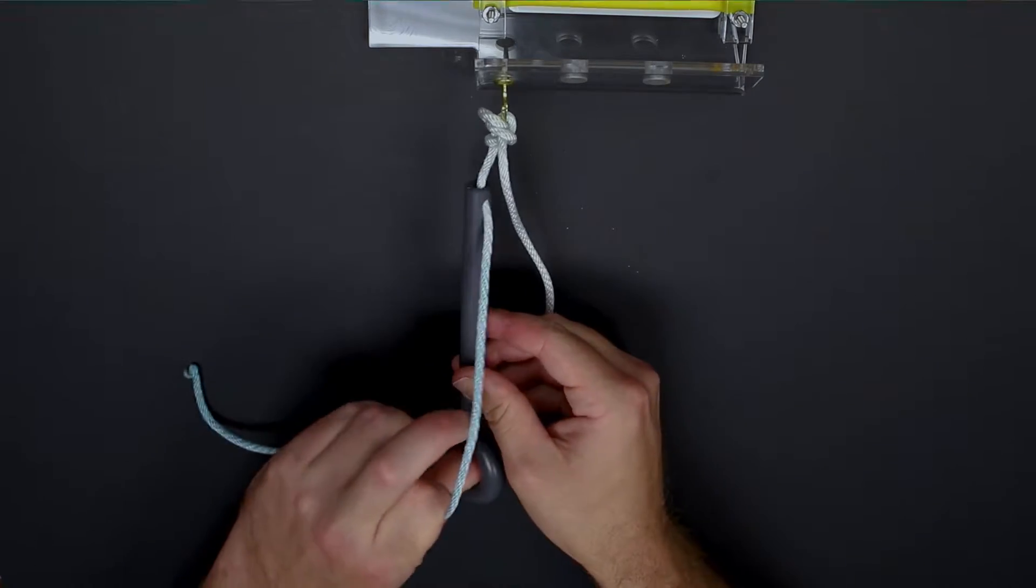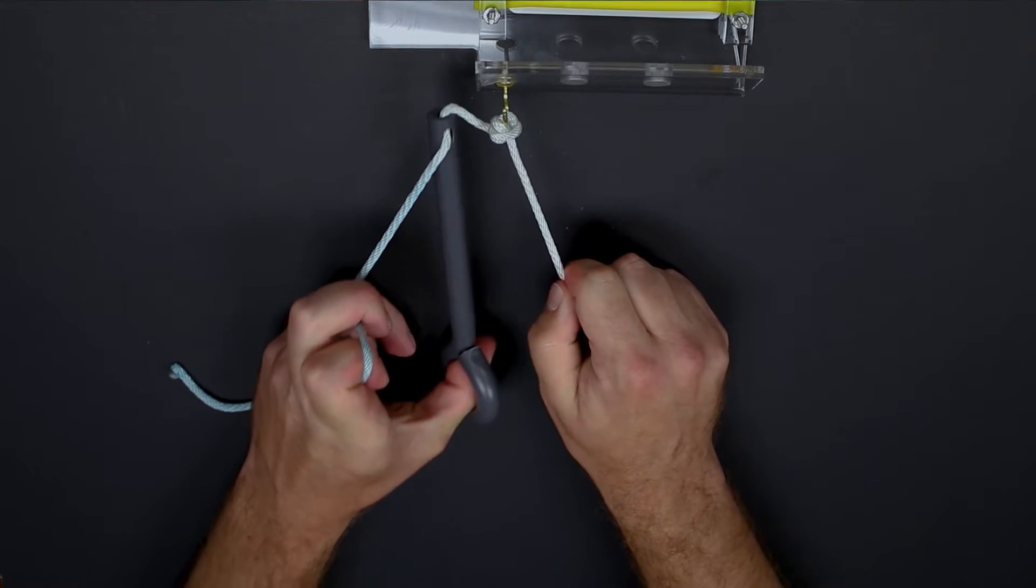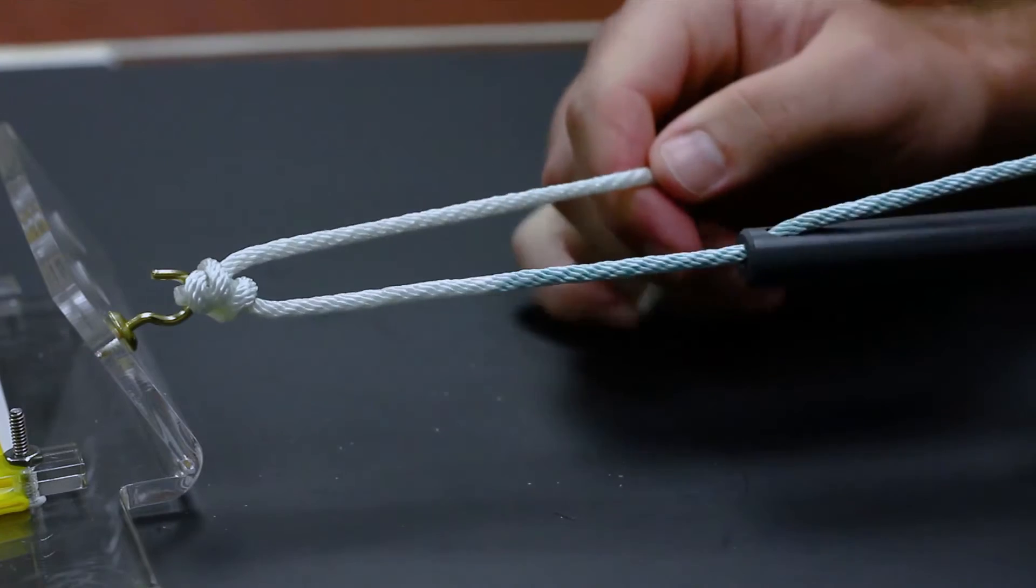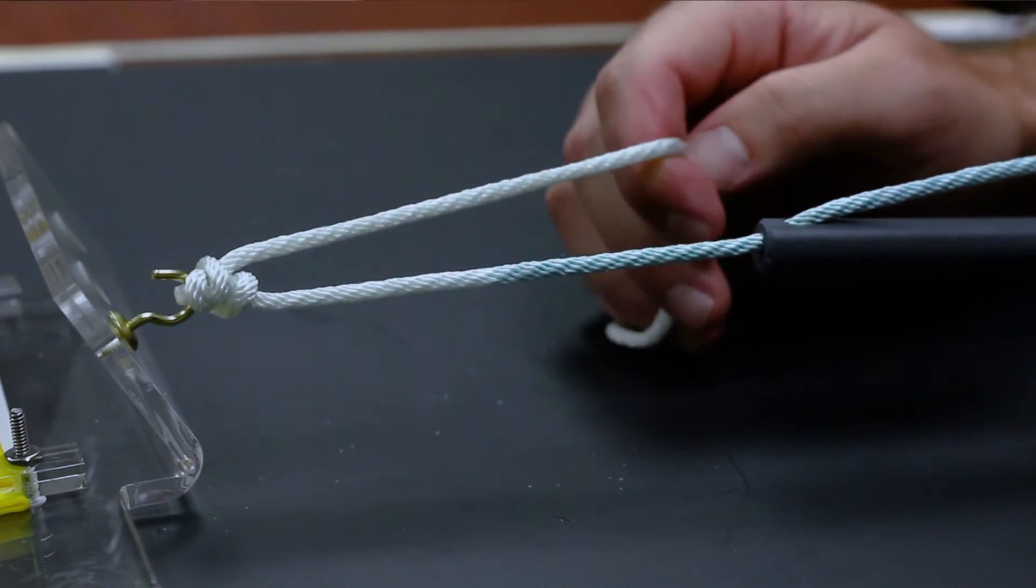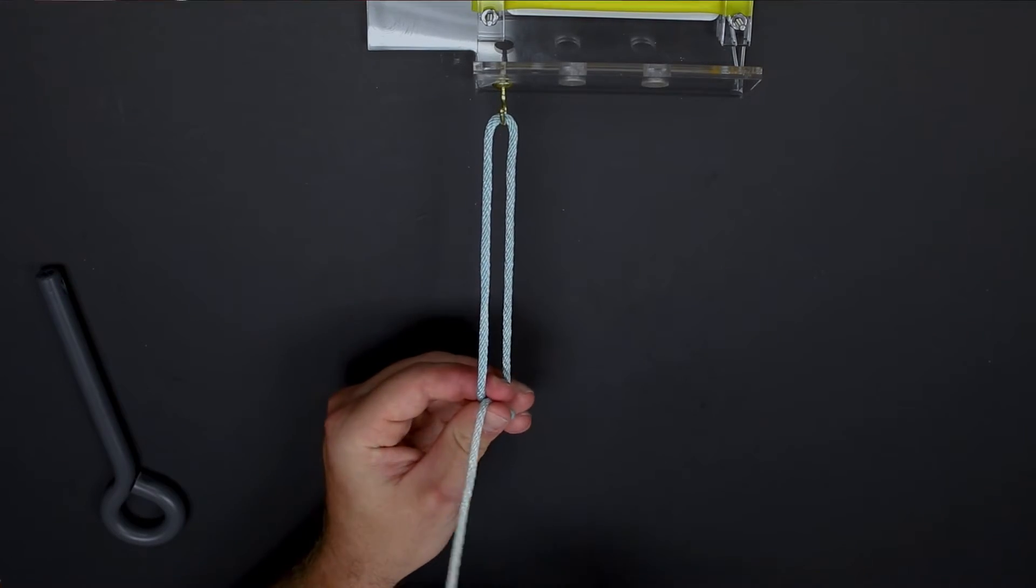When we are ready to lock the knot we simply pull on the loop limb and this secures the locking mechanism. We pass for additional tension. We will then secure this knot with three reverse half hitches on alternating posts. SMC or Samson Medical Center knot.